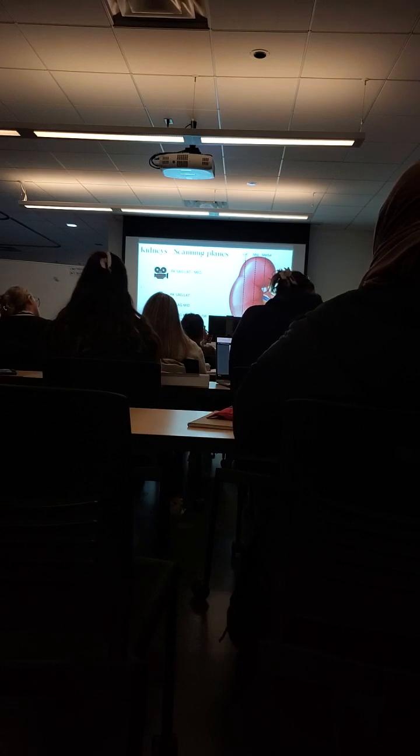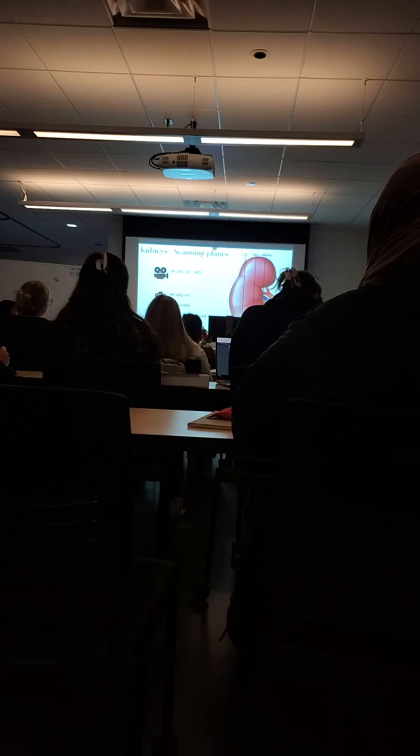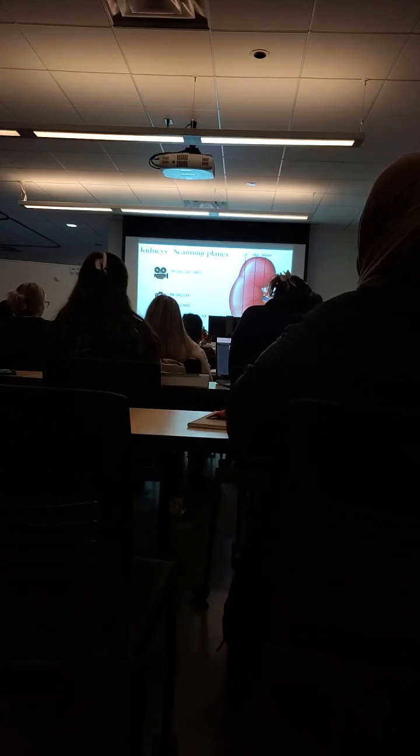So now the doctor can see the whole entire scan of your kidney, and they can freeze it, they can blow it up, they can do all kinds of things. But you need a really good cine. So make sure you're optimizing your image and that it's not too dark up here and not too bright here. You don't want to give pathology. This is where your TGCs really play a role.